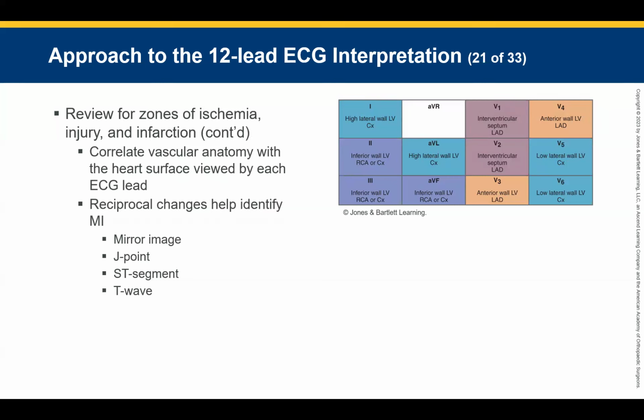Do we need all 3 of them? No. We need 2 of them. Any 2 works. Okay. How many boxes? 1. V1, V2? How many boxes? 1 for V1, 2 for V2. Yes. 1 for V1. V2 has some natural elevation. That's what you need to know. Somebody might ask, why? I don't know that one. That's the way God made us. You can have a little bit of elevation there.